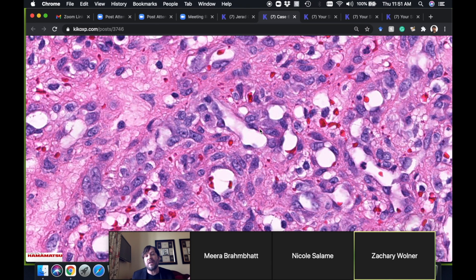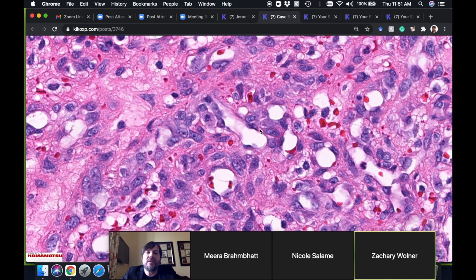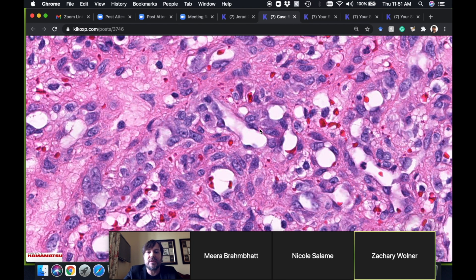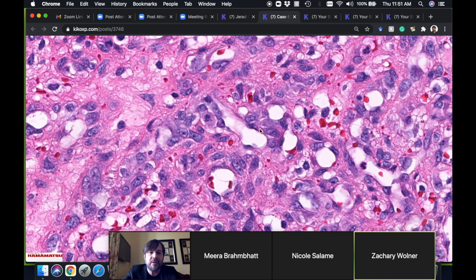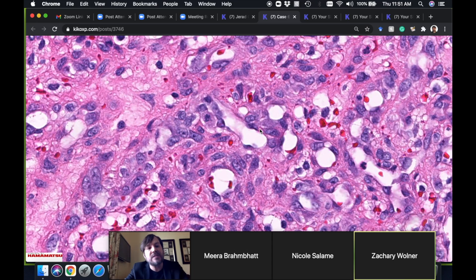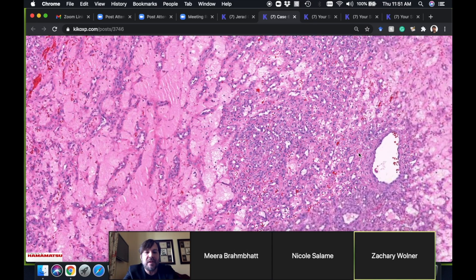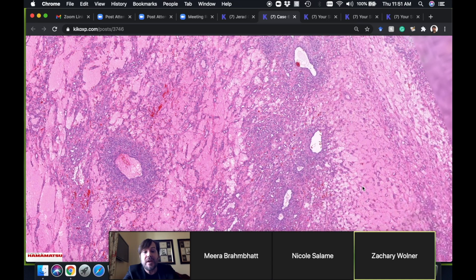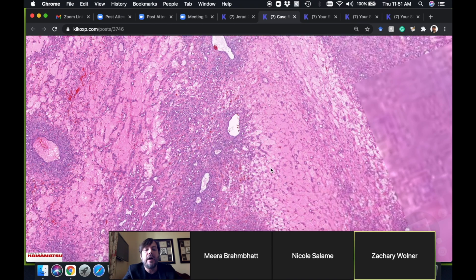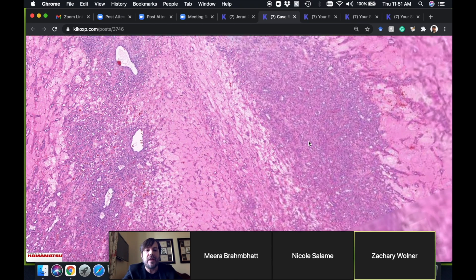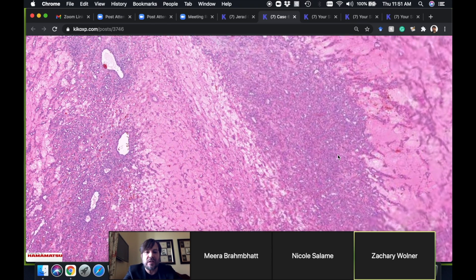Which is kind of frustrating, right? Vascular tumors are really fascinating, but a fair number of times you're left with making a big decision between benign and malignant based on the pattern without a lot of ancillary help. In any case when I have a doubt, what I recommend is close follow-up, because usually an angiosarcoma is going to show itself very quickly—they're often very rapidly growing tumors, not always but a lot of times. So with follow-up, if you end up being wrong, hopefully that can be detected as soon as possible so the patient can get the right treatment quickly.